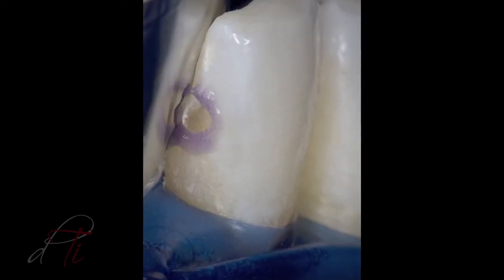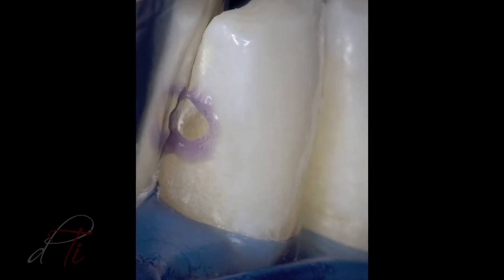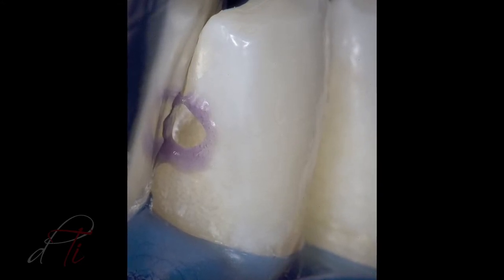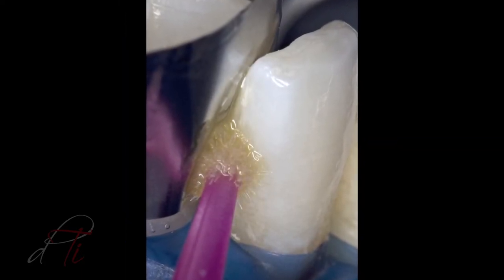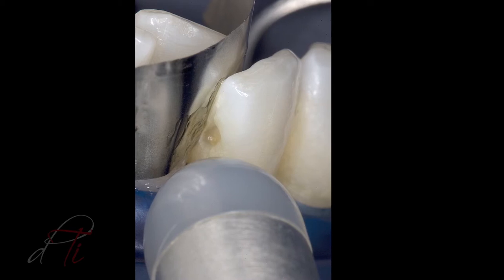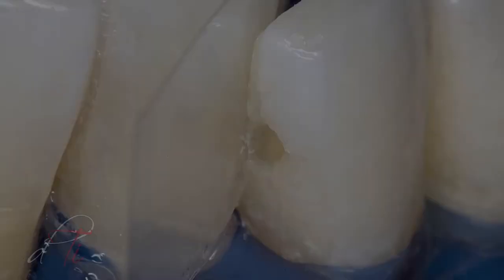The prepared and unprepared enamel was etched with a 37.5% phosphoric acid gel, Gel Etchant by Kerr, for 15 seconds and rinsed for 5 seconds. A self-etched adhesive, Geniobond by GC America, was placed on the enamel and dentin surfaces with an applicator tip for 10 seconds, air-dried for 5 seconds using an 8-ECT warm-air tooth dryer, and light-cured for 10 seconds.